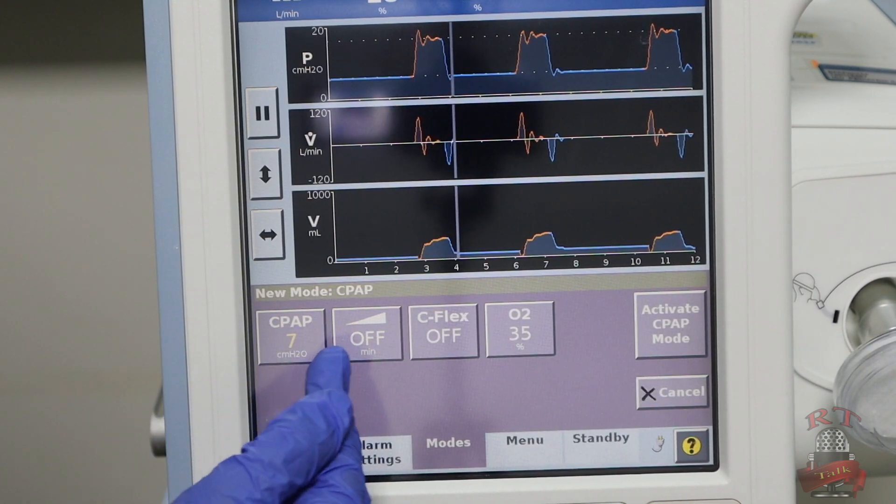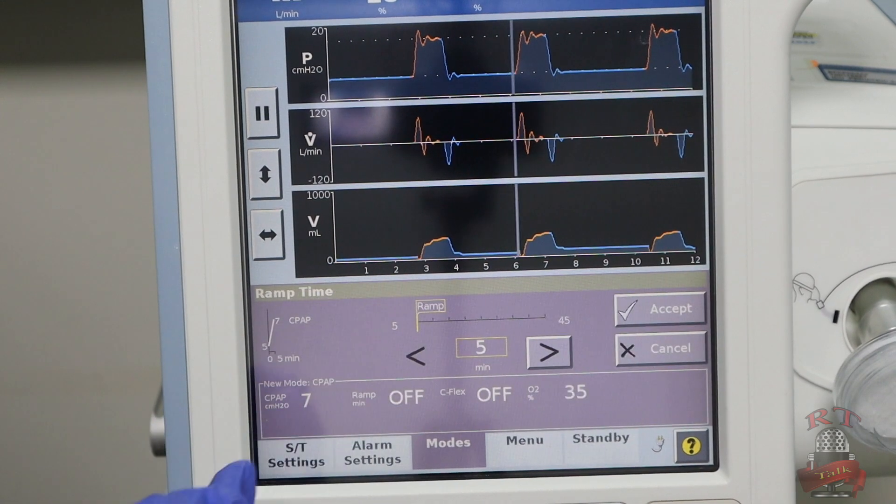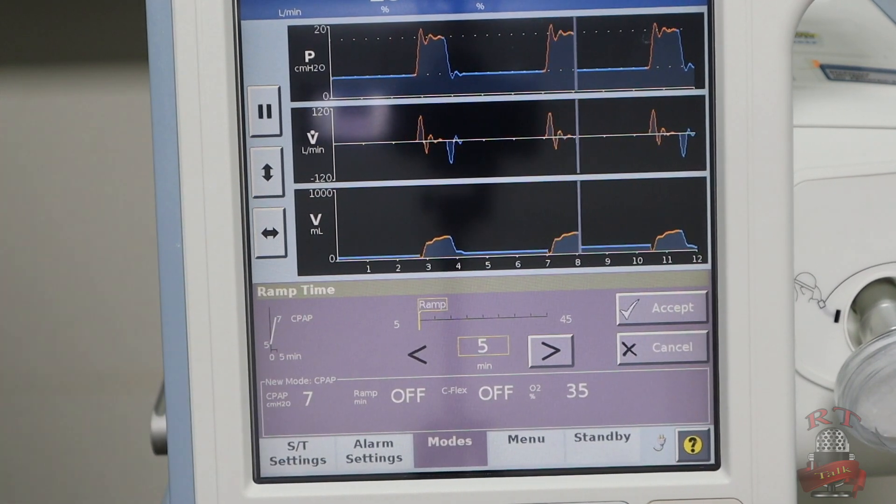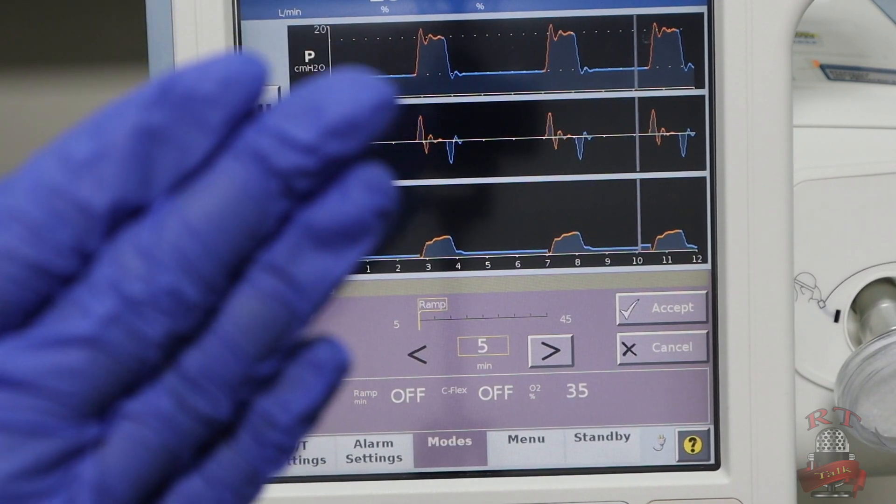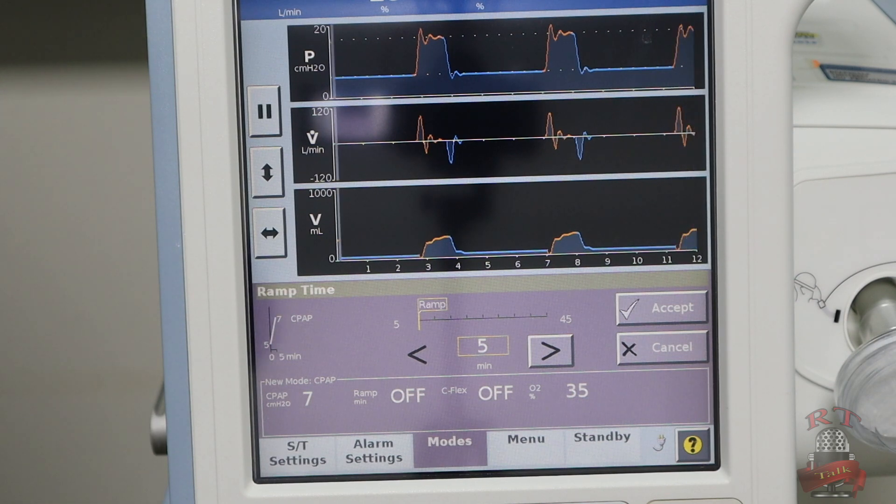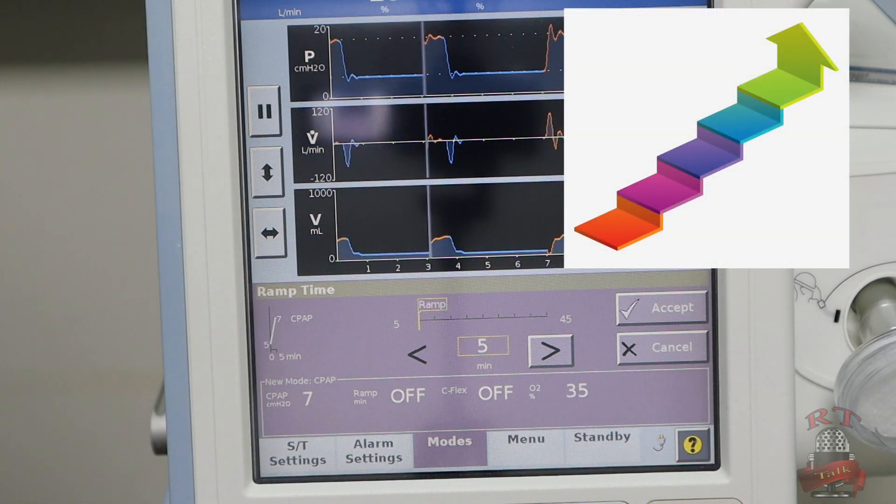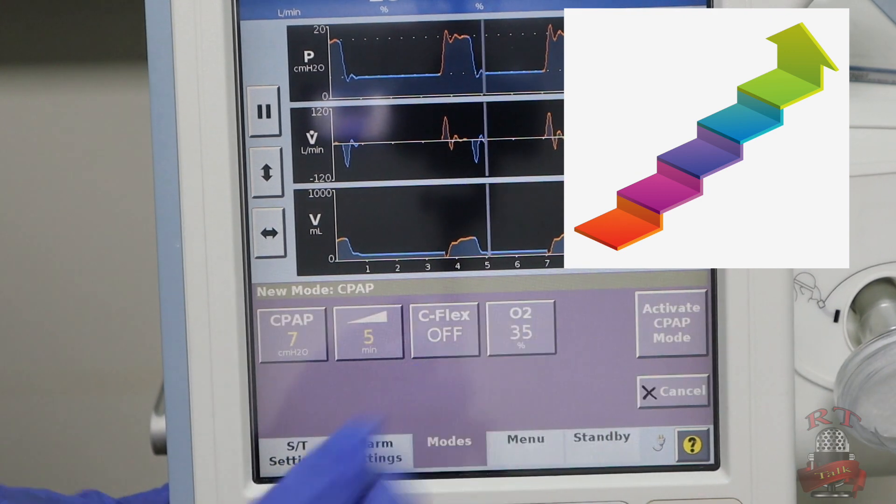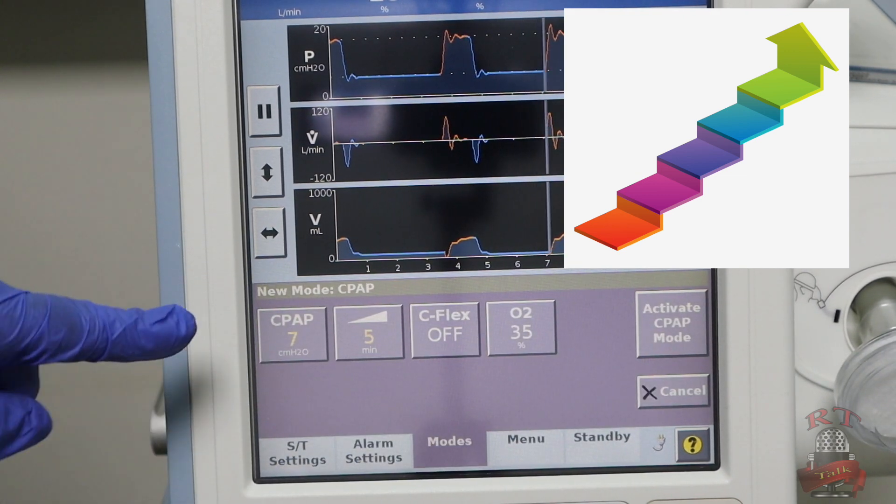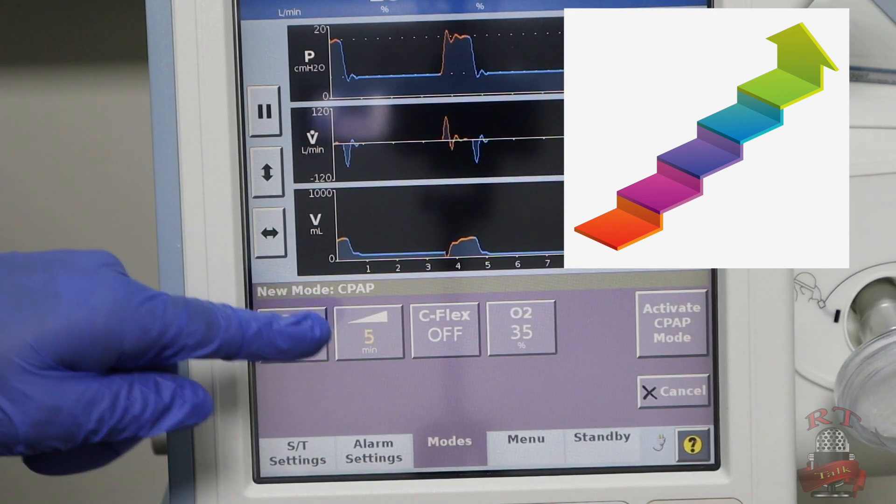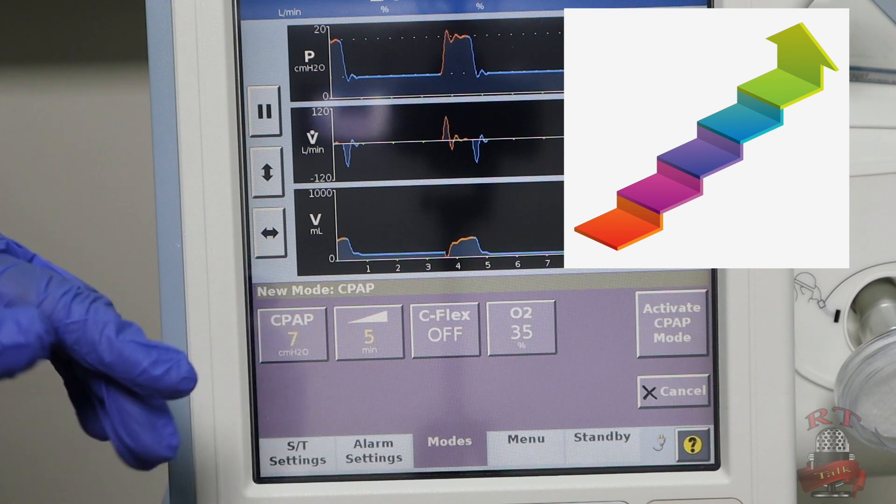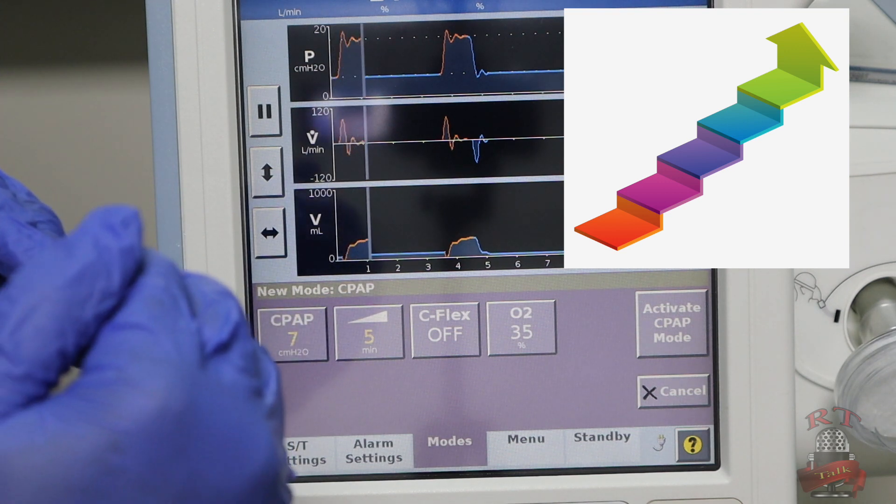The next setting here is the ramp time. Do you want to start your CPAP directly, or you want it to go up gradually? For me, I want it after 5 minutes. So my CPAP now is 7, but the ramp time will let my CPAP start gradually—like 2, 3, 4, 5 within 5 minutes.